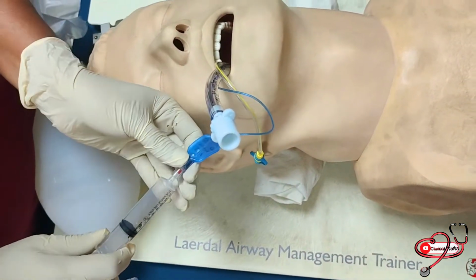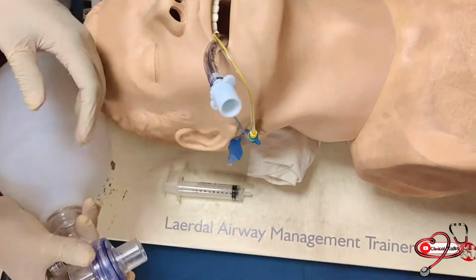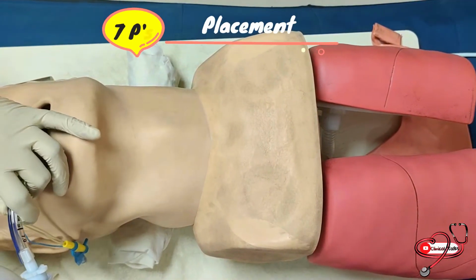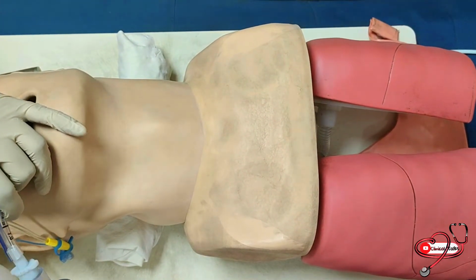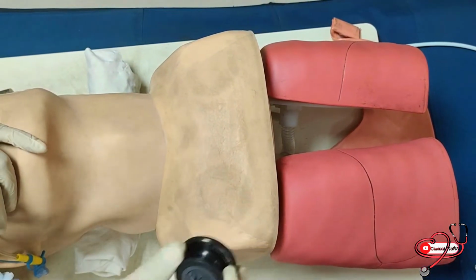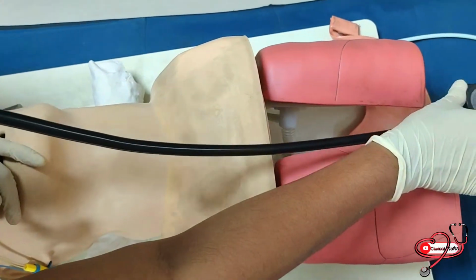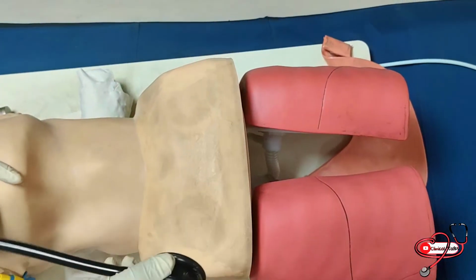So now you need to inflate the endotracheal tube and attach it to an Ambu bag. You need to confirm the endotracheal tube placement by auscultating 5 points, 1 on the epigastrium, 2 at the base of the lungs, and 2 at the apex of the lungs. There should be no sound on the epigastrium, and you should be able to hear the breath sounds on the 4-point auscultation.